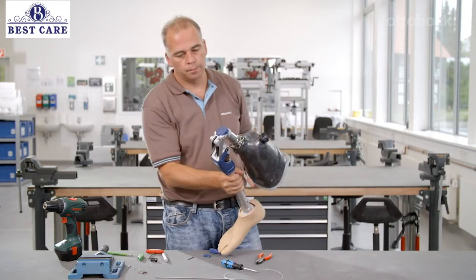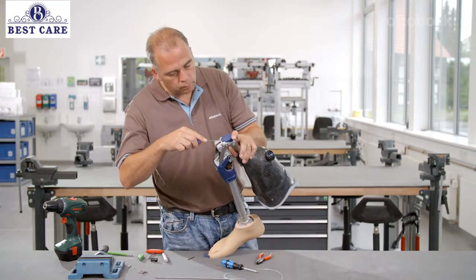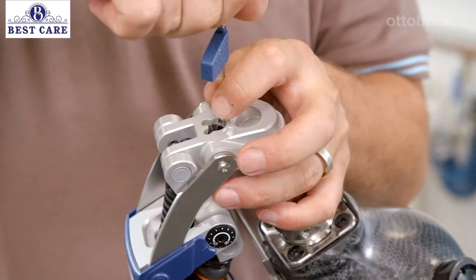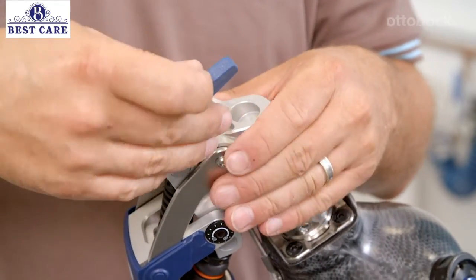With Fion, there is the option to activate the manual lock by removing the screw on the bottom side of the knee joint head. The lock then reliably locks the knee in full extension and can only be unlocked when the lock release cable is pulled.